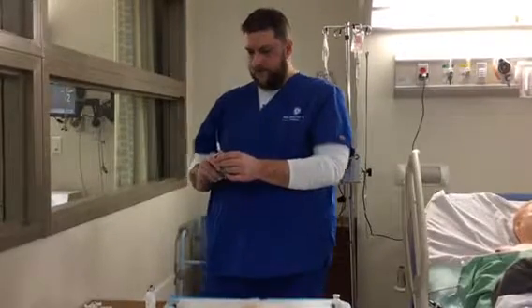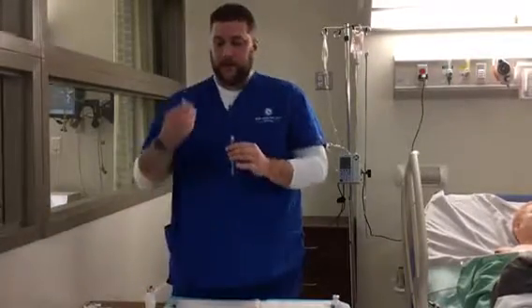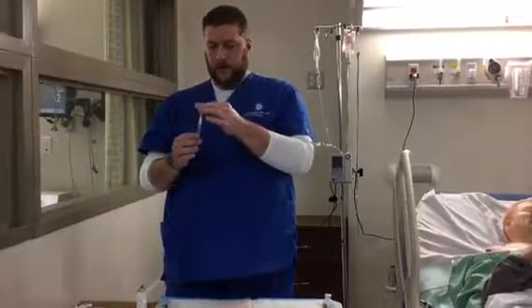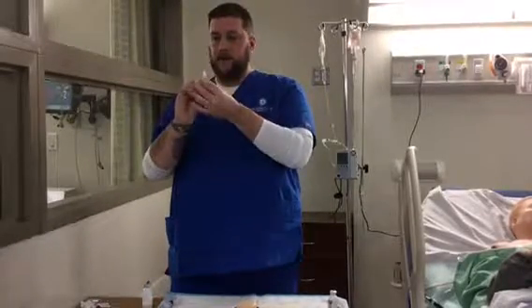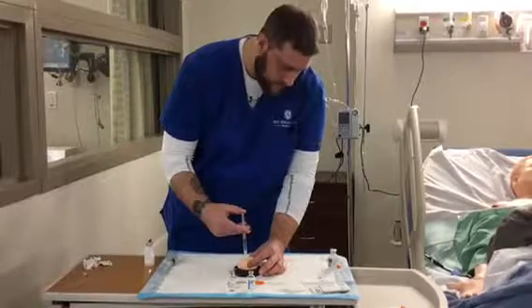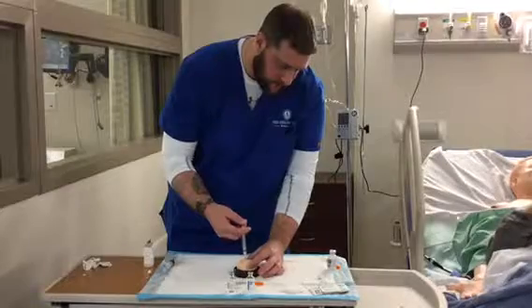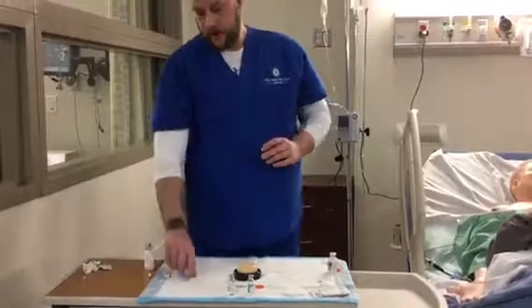Once the air is gone, I will remove the filter needle and replace it with the regular needle. At this point, uncap it. Again, making sure there's no air in it, and it's going to be done the same as all the other ones. To push up on the skin, you want to insert it at a 90-degree angle, straight in. You want to expel the medication into the skin, relax, and withdraw. And again, this would be put in the appropriate location. And that's how we do the med administration.